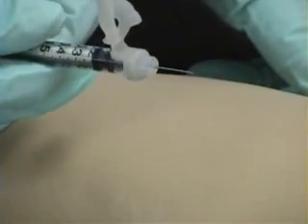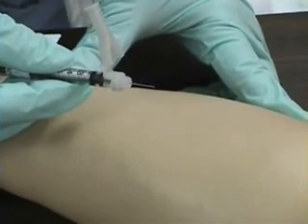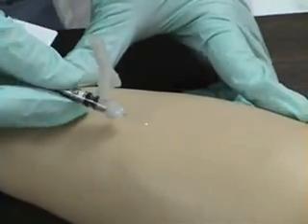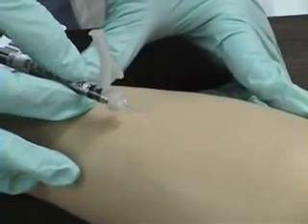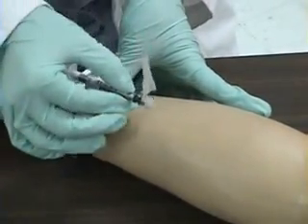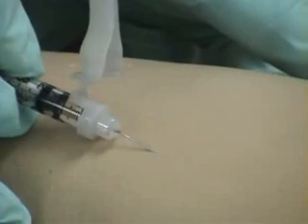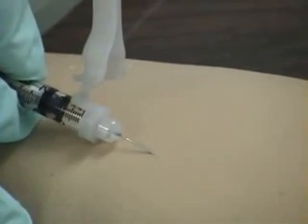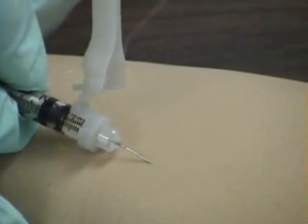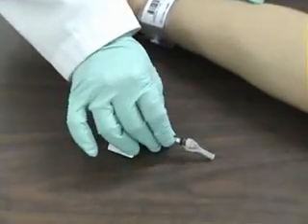Before giving this injection, it is important that the bevel or tip of the needle be facing up so that once the medication is administered, you will have a bubble or a wheal under the skin. The angle for this injection is 5 to 15 degrees, which ensures the medication goes into the dermal layer of the skin. Insert the needle approximately an eighth of an inch so that the bevel is fully under the skin. With my non-dominant hand, I'm going to secure my patient's arm, and with my dominant hand, I will hold the syringe on top and inject.